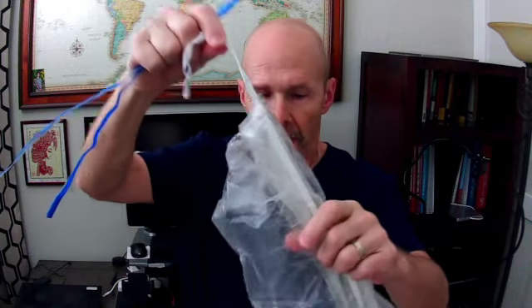So once you're done with the surgery, the LI Endofield will be in place like this, and this end will be towards the trocar, or if it's an open case, you just lift the entire device out. But if it's a laparoscopic case, you simply grasp the railing, and it'll come out. You'll get the other railing, and it'll come out. And now you just pull on the tab, the bag will close, and all your debris will be inside the bag. Now you can pull it up through the trocar and open the bag if you'd like and drain out all of the debris. Or if you're doing an open surgery, just lift it out.